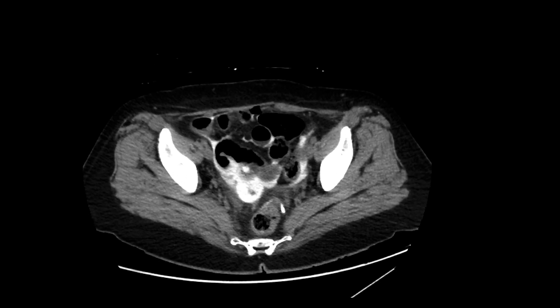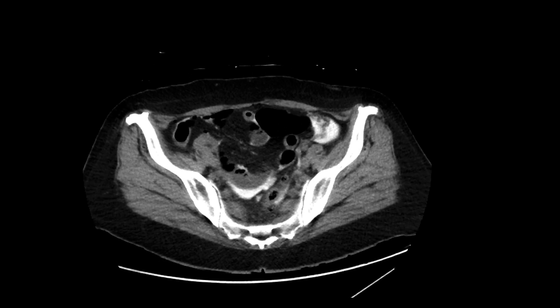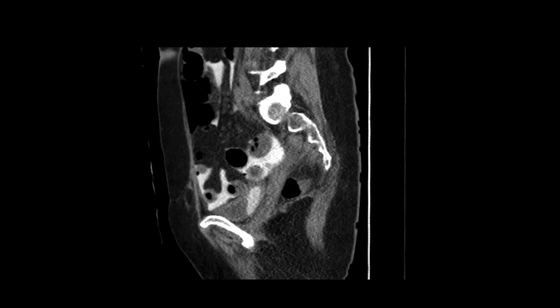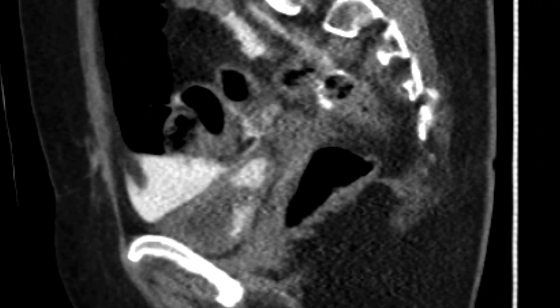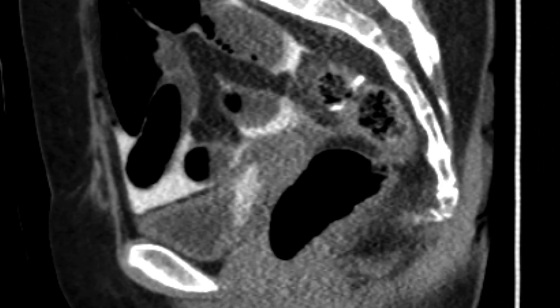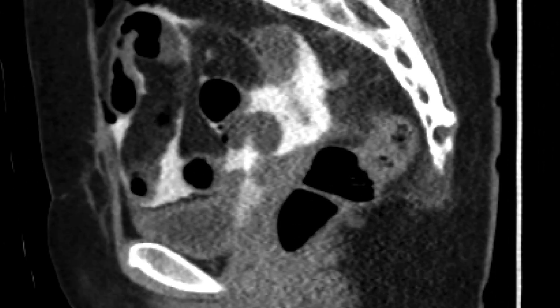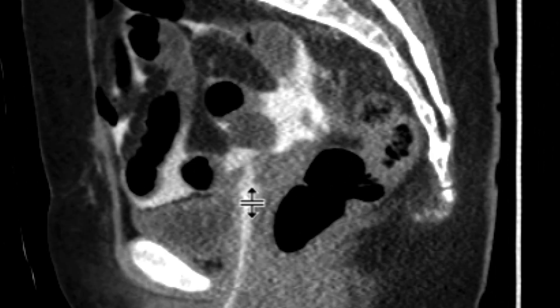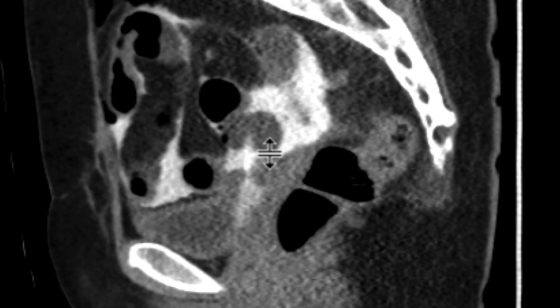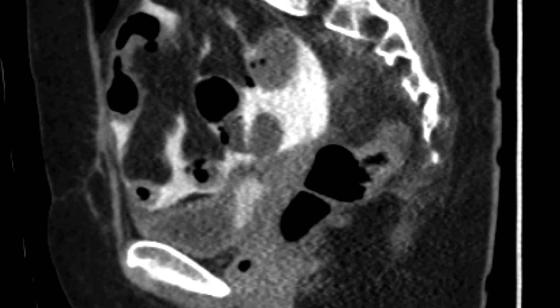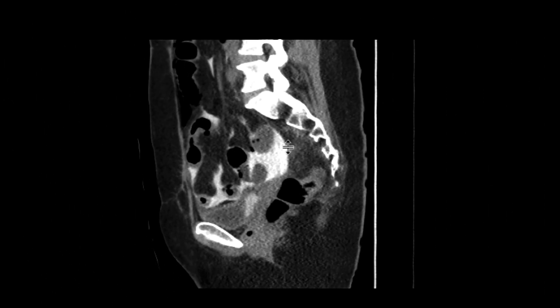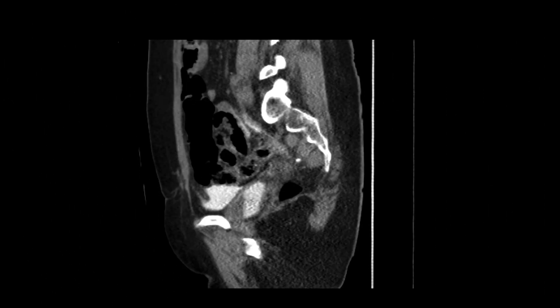So this indeed is an intraperitoneal bladder rupture. And what's interesting, when you look on the sagittal image over here, we can see that there's a Foley catheter within the bladder. But in fact, the Foley catheter has pierced through that injury within the bladder dome. The balloon of the Foley catheter is in fact inside the intraperitoneal space, and all that contrast is leaking outwards from there into the peritoneal cavity.